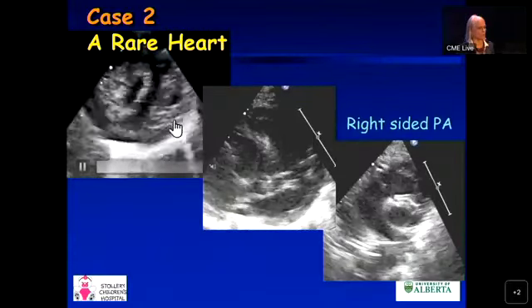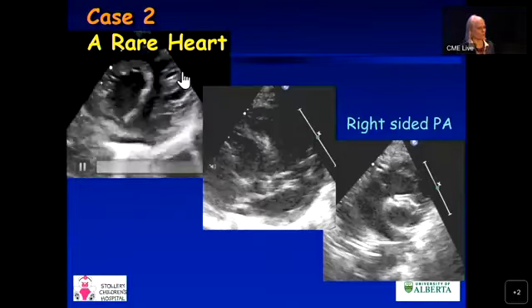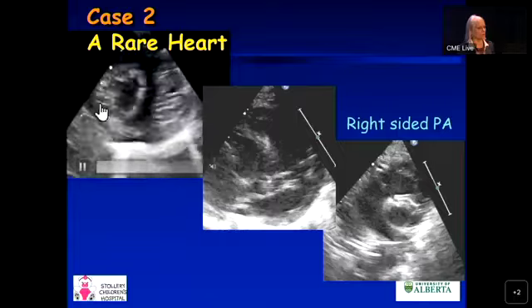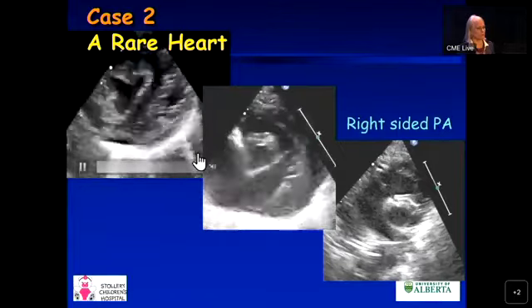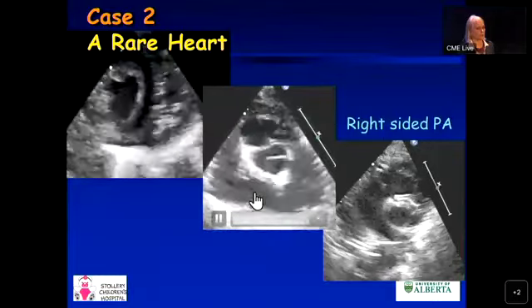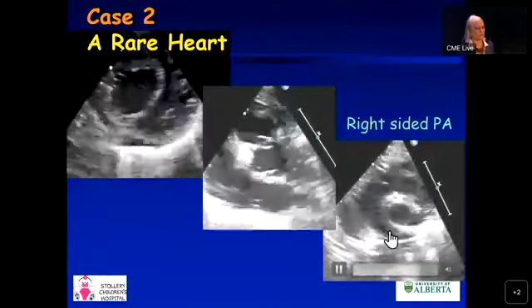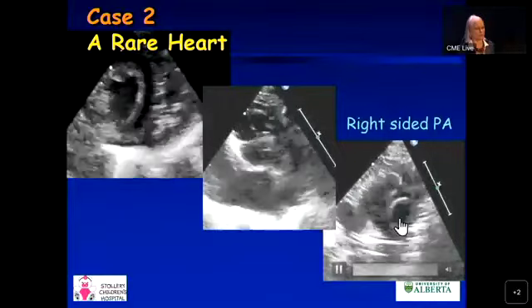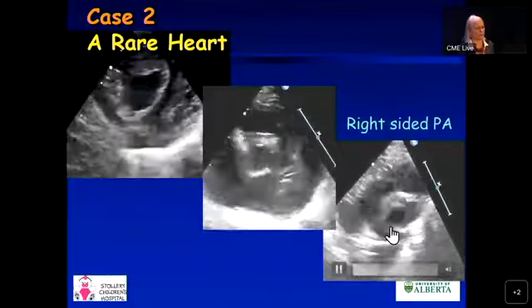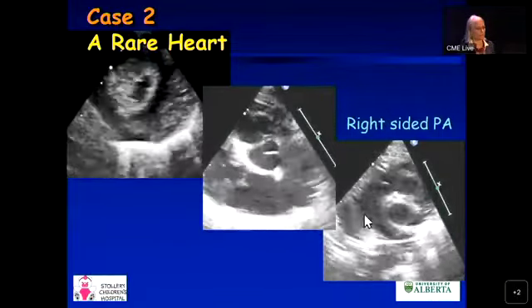This is a little bit more of the images. So here's your left-sided right ventricle, right-sided left ventricle, something that we are more used to seeing, and then the great vessel relationship. And in fact, this was the best one because it's really an inverted relationship with the great vessels, with the aorta here and the pulmonary artery wrapping around to the left, or to the right, sorry, wrapping around to the right, and the SVC is here.